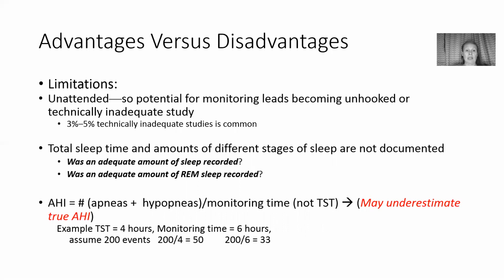And 3 to 5% of the studies actually are inadequate and have to be redone. The total sleep time and the amounts of different stages of sleep are not documented, so we have no idea if the patient actually got enough sleep. We have no idea if they even got REM during the monitoring time.